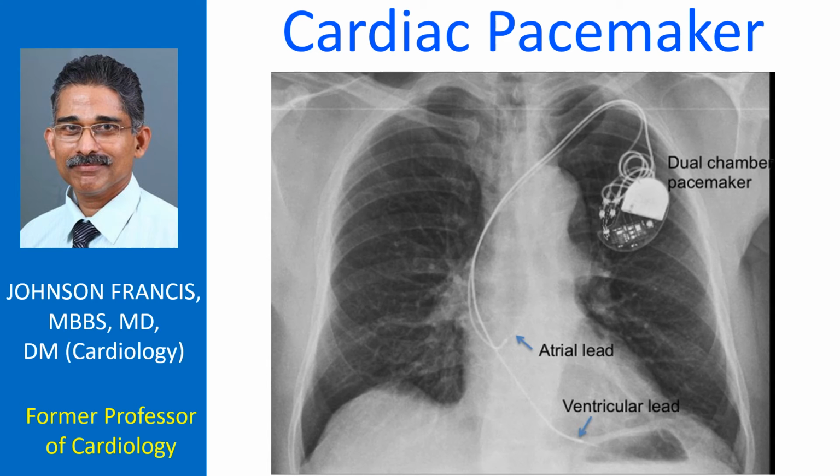Pacemaker is not a device which can be left alone once implanted. They require regular evaluation in a pacemaker clinic and periodic reprogramming as the needs of the body change. In the pacemaker clinic, the programmer head is kept over the device implanted under the skin and interrogated using radio frequency signals. The result is printed out or seen on the programmer screen and analyzed by the cardiac electrophysiologist, a physician trained in the treatment of electrical disorders of the heart.